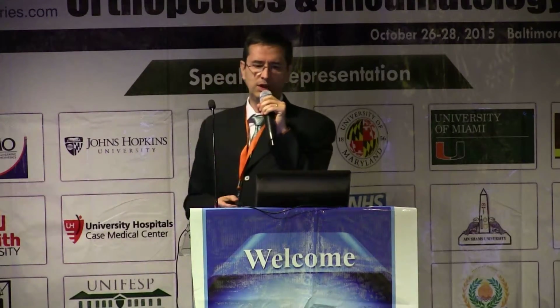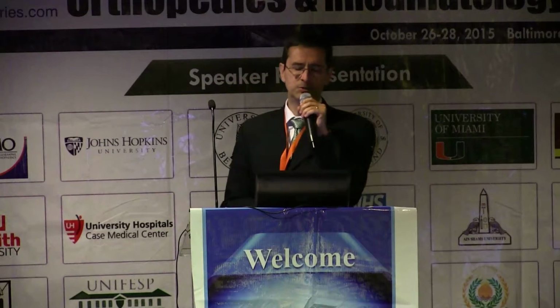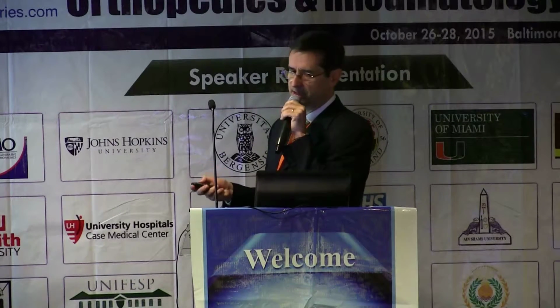Basically, what we assess by ultrasound in the carpal tunnel syndrome are the changes of the median nerve, which makes it crucial to understand the anatomy of the peripheral nerve. Peripheral nerves are composed of the fibers and the supporting tissue.